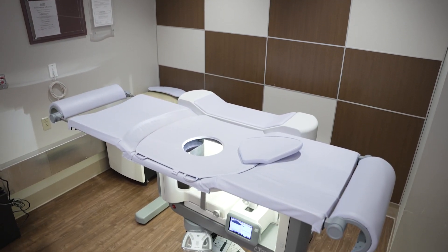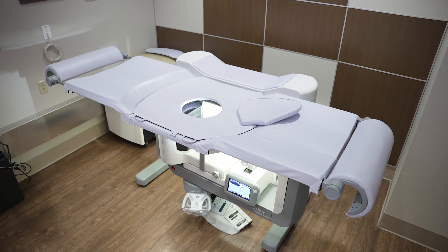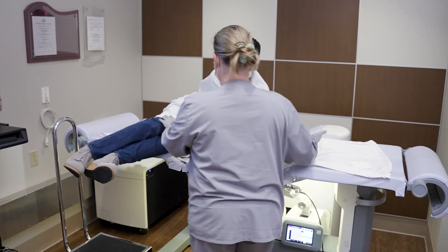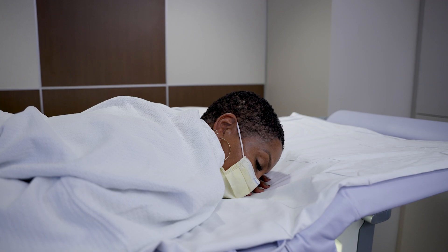During a stereotactic needle breast biopsy, we'll use a special table with a mammogram machine positioned underneath it. Our technologist will get you positioned on the table so that the abnormality in your breast is in good view of the mammogram machine for the radiologist to exactly pinpoint the location.